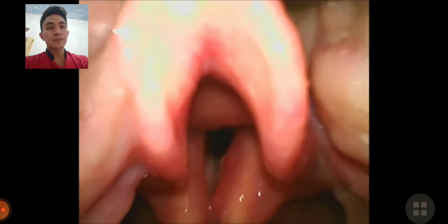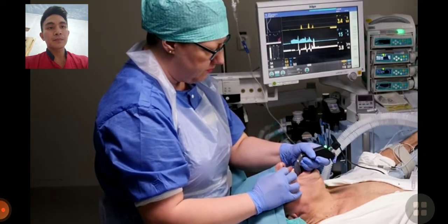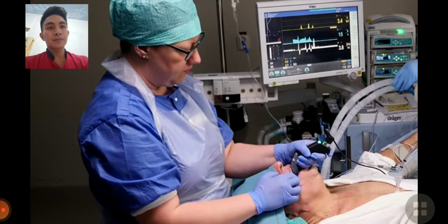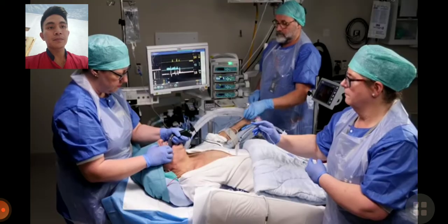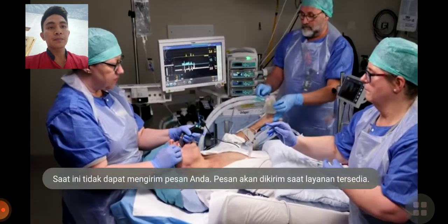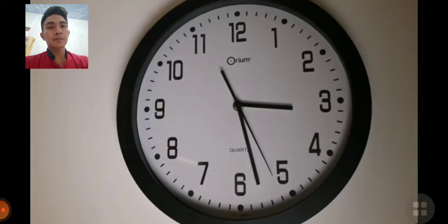A common mistake at this point is leaning forward, as it feels this will give a better view. It doesn't. Stand upright with the left arm at a 90-degree angle tucked in towards your body. This allows for better ergonomics, better communication with the team, and a better overview of the ventilator, the timer, and the patient.